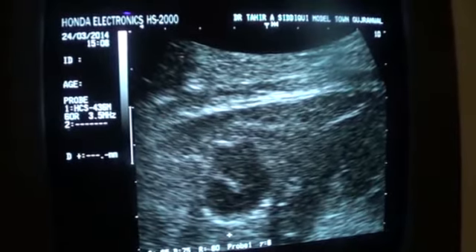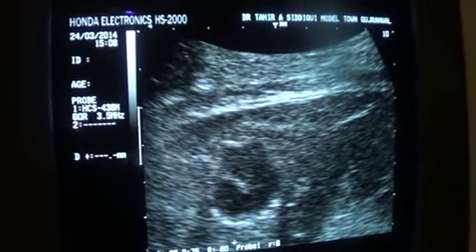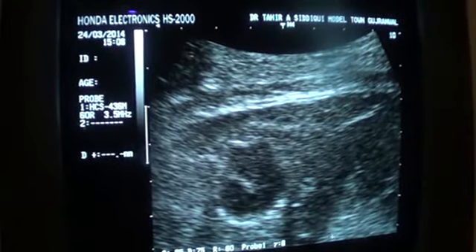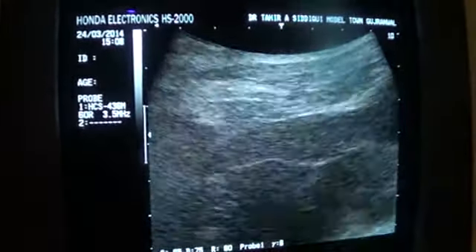This is a focal lesion. This is not a simple cyst. Remember why it is not a simple cyst? Because we do not see any posterior wall acoustic enhancement. The posterior wall echogenicity or brightness is equal to that of the liver surrounding this cystic area in a cirrhotic liver.